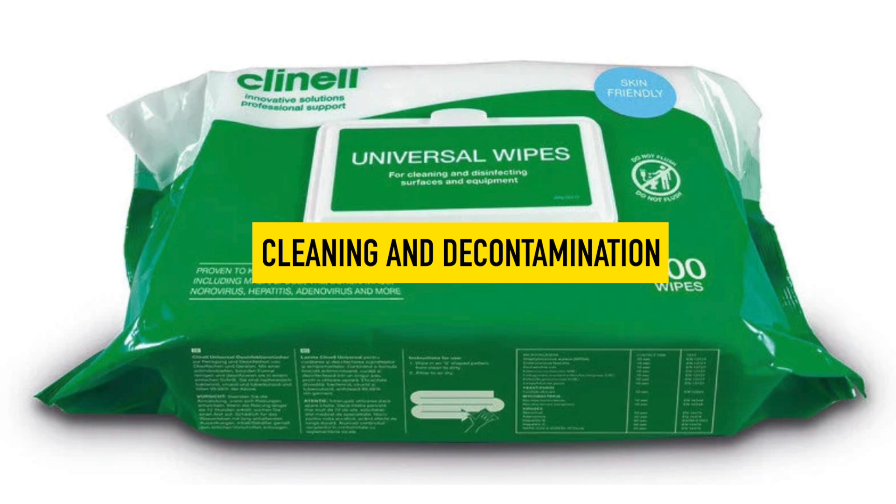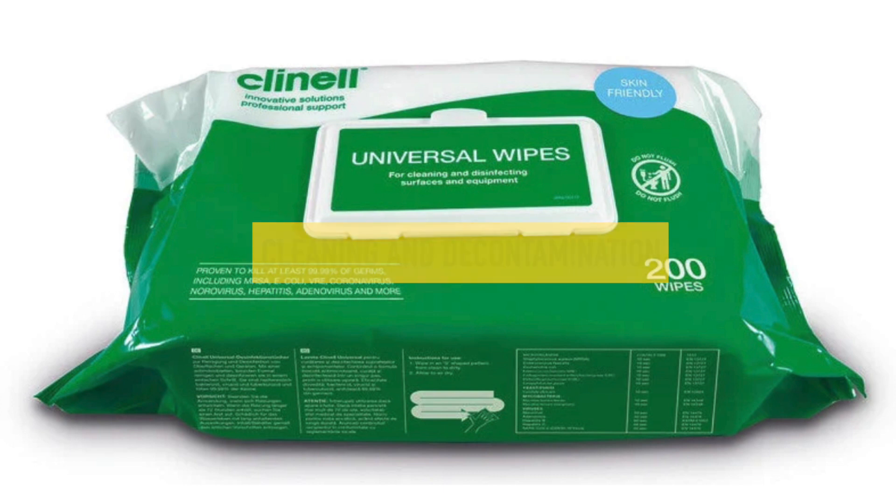Cleaning and decontamination. Clean the device using green Clinell wipes and wipe down the entire nerve stimulator for at least 15 seconds. Let the device dry at least 5 minutes before using it on a patient. Ensure all obvious signs of dirt and contamination are removed. Store the device in a clean, dry environment.